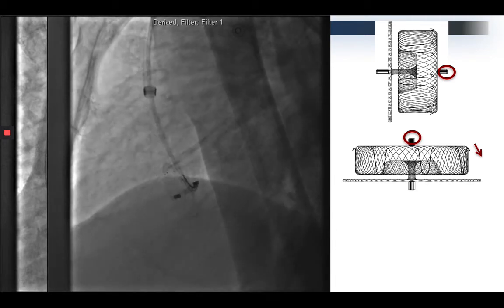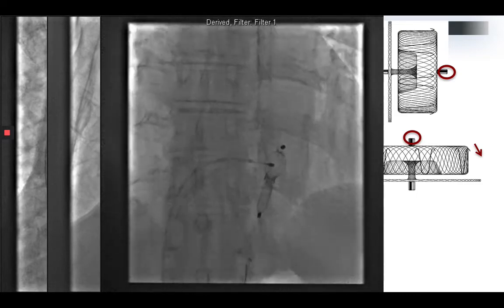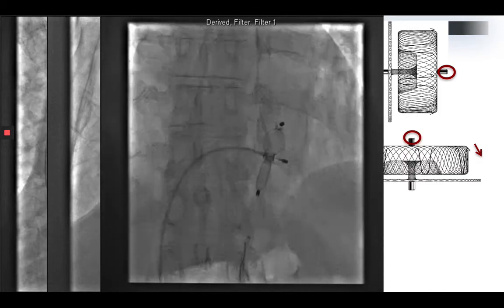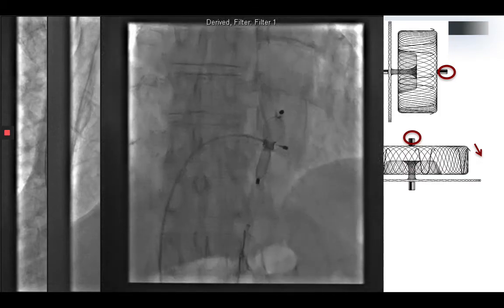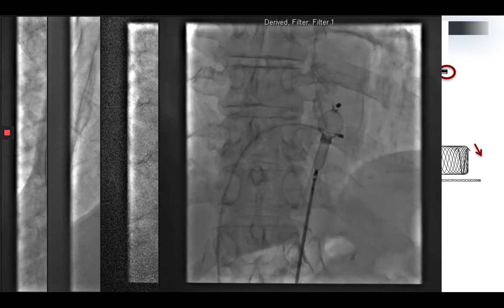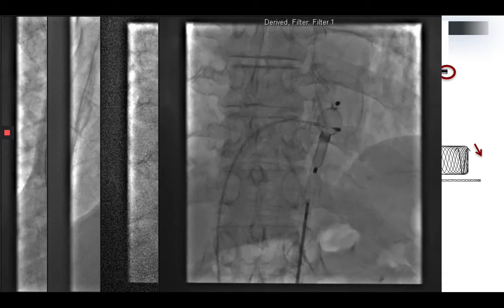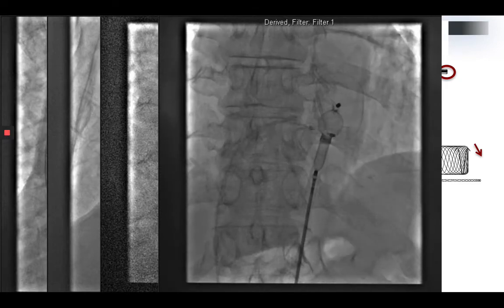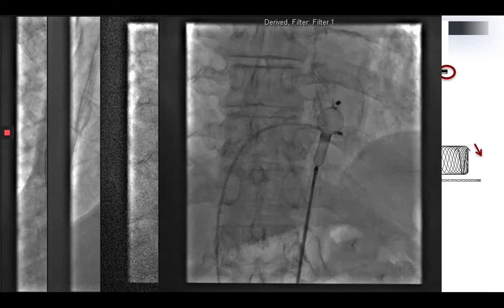And this time we managed to pull it across the aortic valve into the ascending aorta and down to the descending aorta. And as we were trying to pull it into the 14 French sheath at that time, the gooseneck snare had come off the end screw itself. So we had to now switch gears to using a bioptome inside this 14 French sheath and try and grab and pull the end screw and the rest of the device into the sheath.